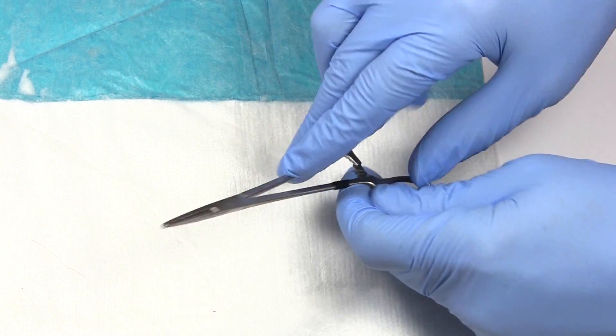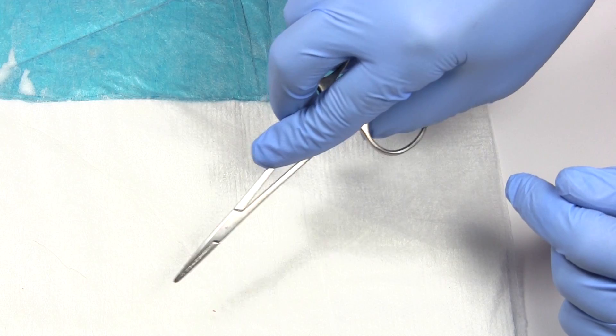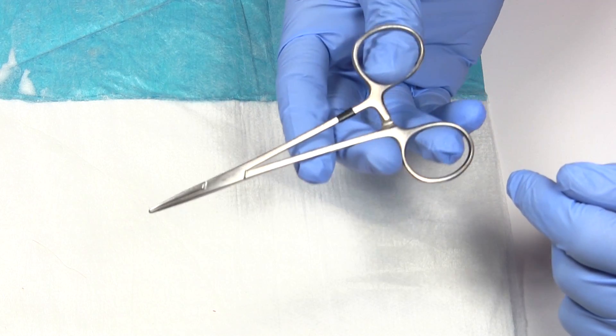You need a pair of hemostats, which are good for separating tissue, clamping off vessels — lots of uses for hemostats.